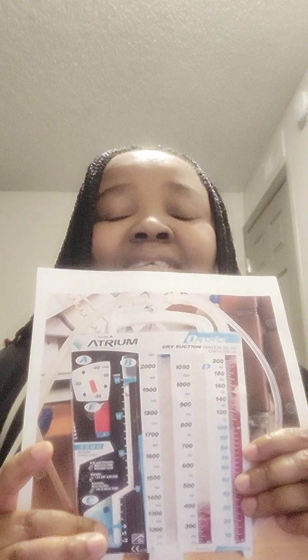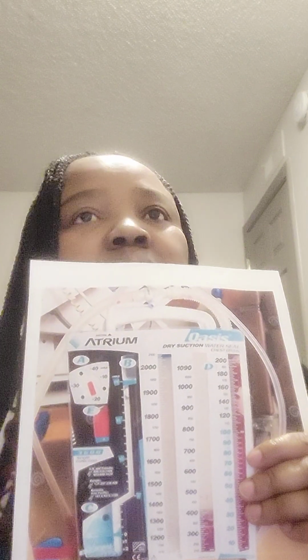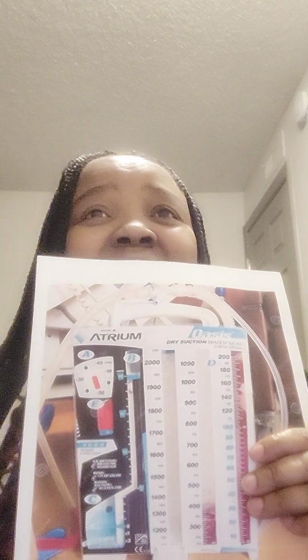But if it is not pneumothorax, it may be hemothorax, or they're trying to take out fluid from the pleural space, and you see increased or continuous bubbling here, there is an issue with that, and you should reach out to the provider. So I hope that the difference is clear.